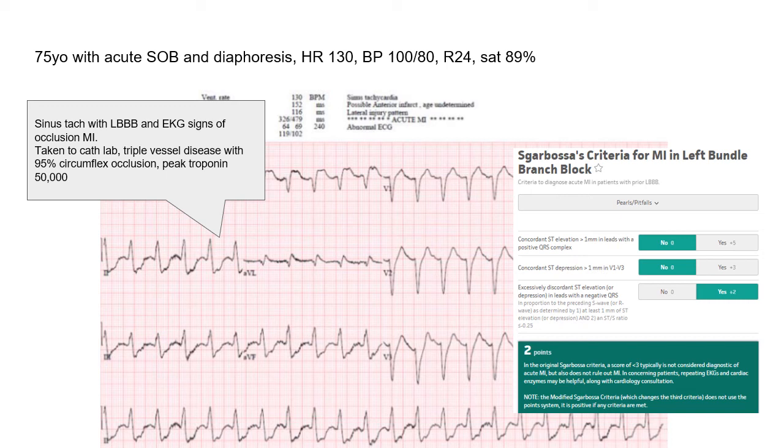And so this one's a little bit tricky, but this one looks to be pretty even. When we see something that's more even, then we get worried, especially down here. This one looks to be more negative, and so we have a kind of concordant ST depression with that. And then we see some ST elevation here, but it's discordant, right?